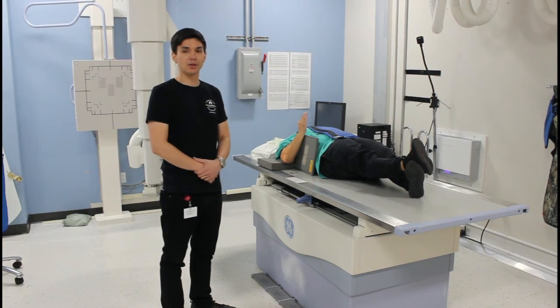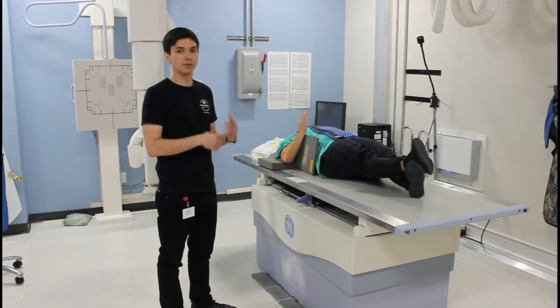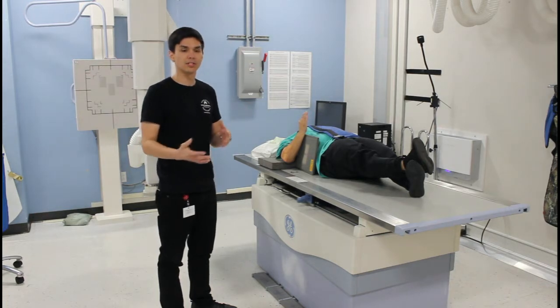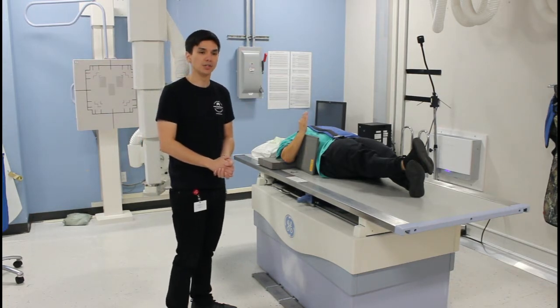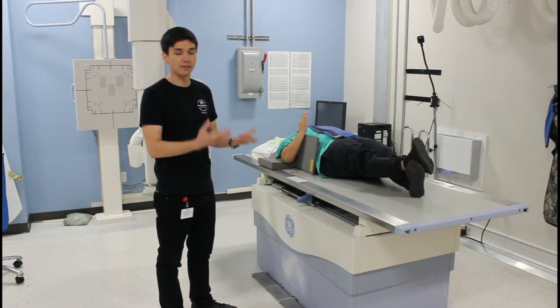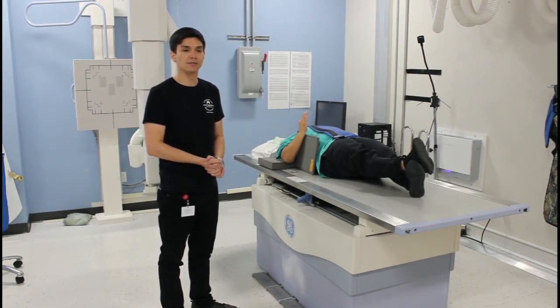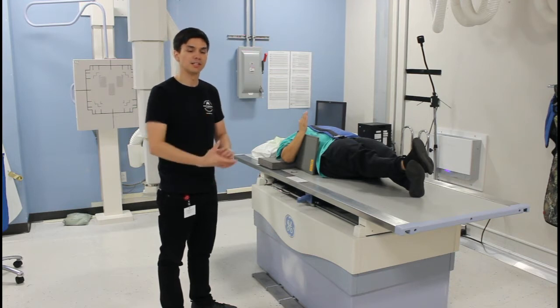So we're going to continue with the Coyle method, and this one is going to be focusing on the coronoid process of the ulna. So, similar to the previous supine position that we showed you, we are taking advantage of that tube angulation to elongate the coronoid process of the ulna when the patient cannot fully extend their arm.